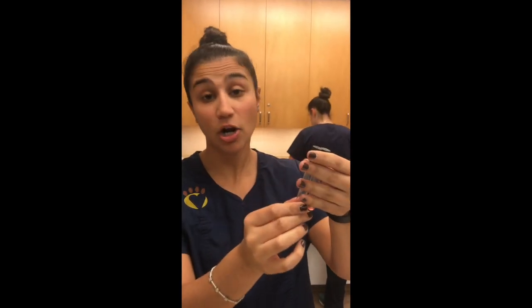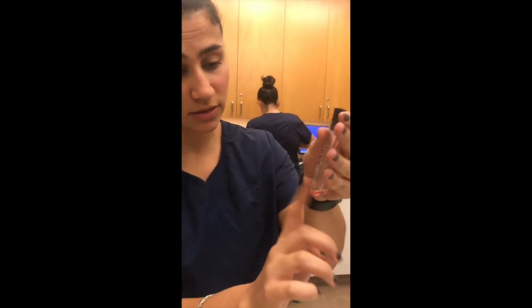Okay, so there's definitely agglutination in our major and minor ones, if you could see. So that means that there is not a cross match. And now I'm going to test our controls by doing the same thing.